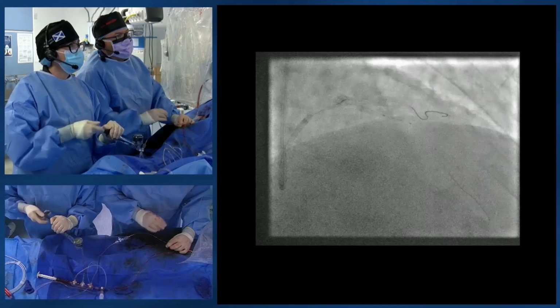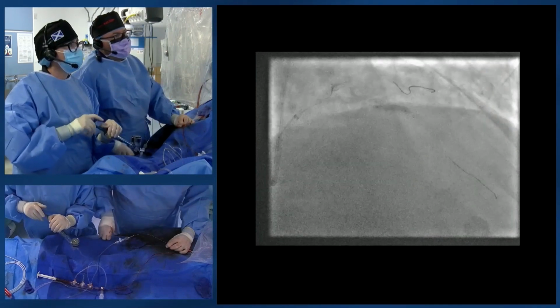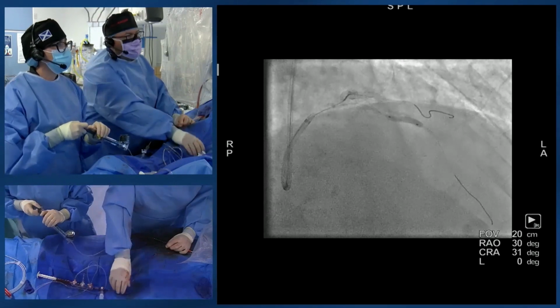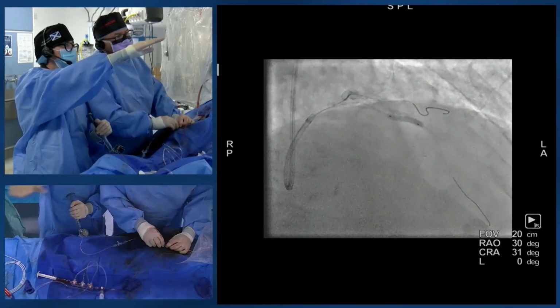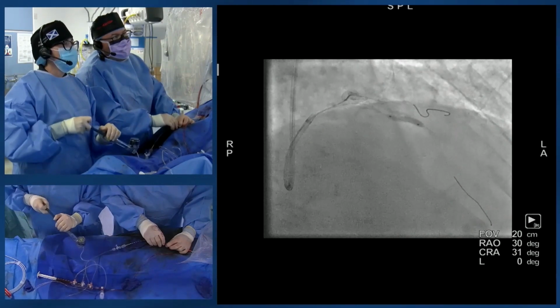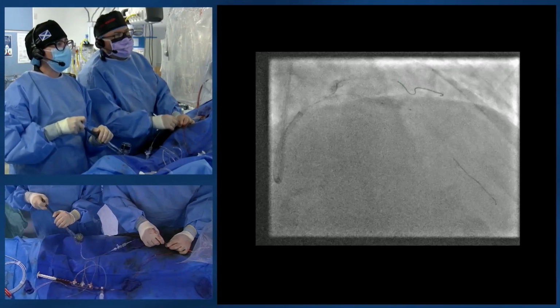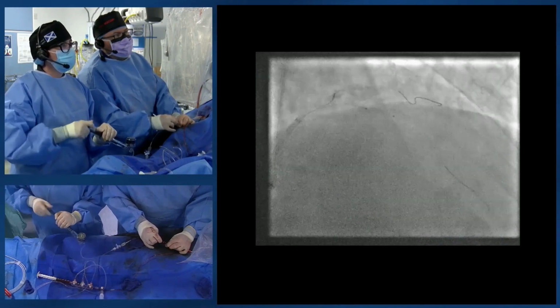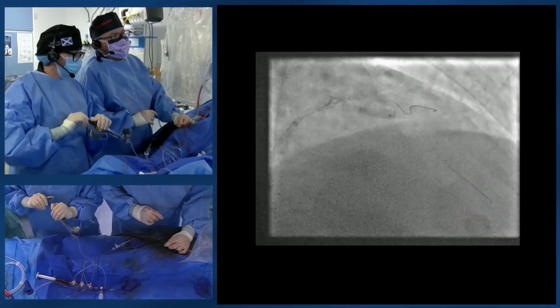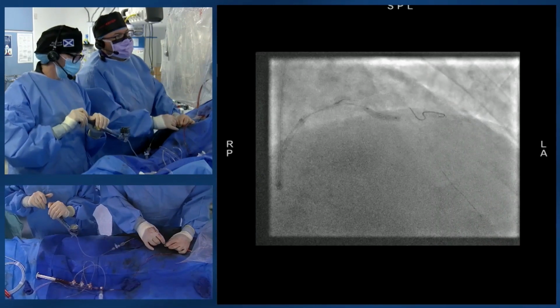And this is our area of interest. Okay, well, that looks pretty good. Yeah, a lot better, Margaret, doesn't it? It's proximal, but it's a wee bit... But you can appreciate that really dense, thick shelf of calcium up there. See that? You don't need OCT to tell you this is calcified, do you? But some of that's going to be deep into the vessel wall, and it hopefully shouldn't affect our luminal areas once we've stented.